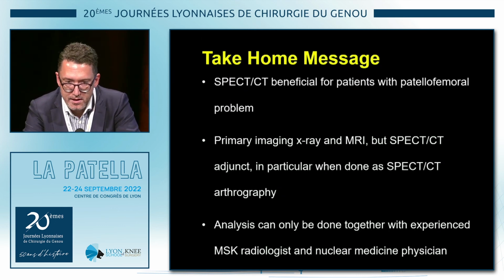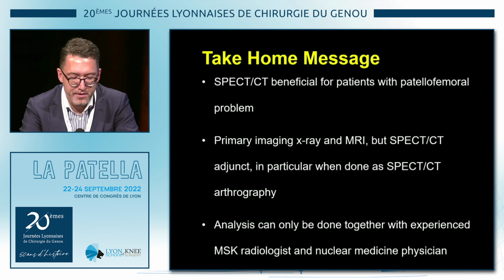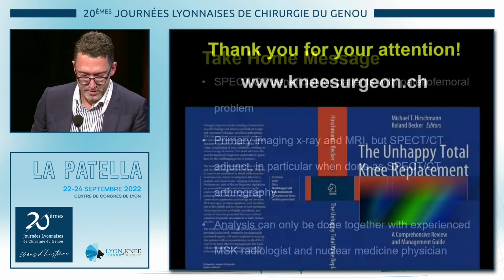So coming to the end, I have 10 seconds left. SPECT-CT is beneficial for patients with patellofemoral pain. It doesn't show you that there is pain. It shows you the bone tracer uptake. It's an adjunct imaging to X-ray and MRI, and the analysis should be done together with an MSK radiologist and nuclear medicine specialist. Thank you very much.